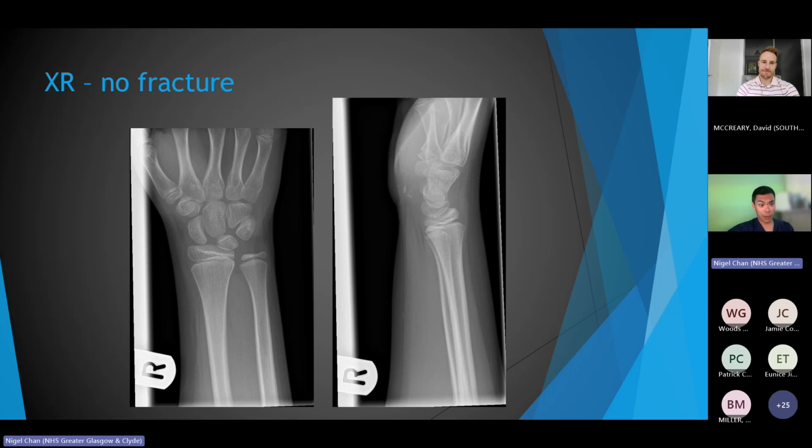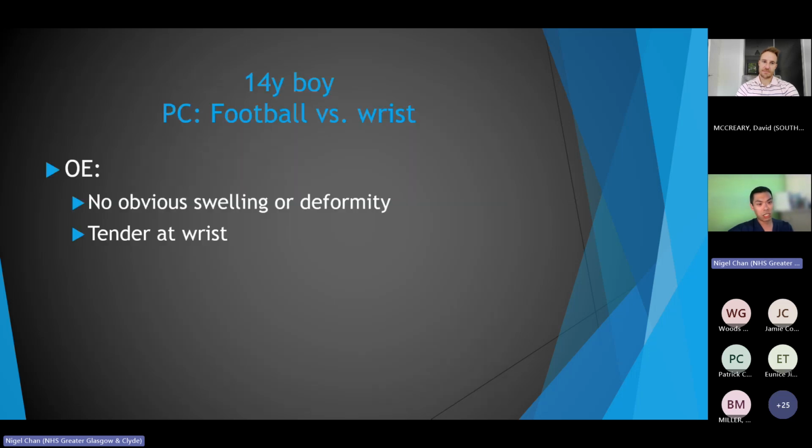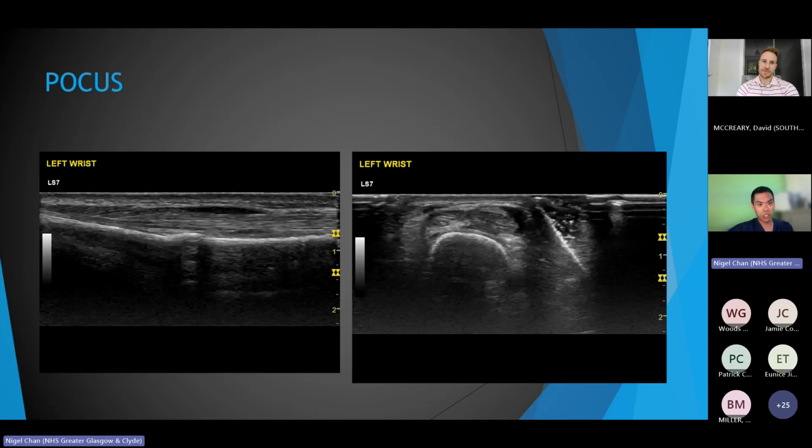And the reason I'm mentioning this is because for injuries like buckle fractures or clavicle fractures, almost all of them don't need any kind of active management. They're just managed conservatively and sent home. They don't need followed up. So really, they don't really need x-ray. So we could just do this instead and save them hopefully a bit of time in the department and irradiating for no reason. We'll just fire through these quickly. I'll just show you the pictures.